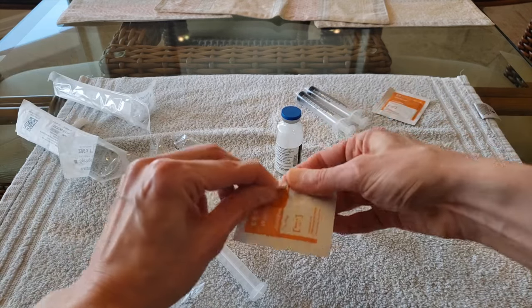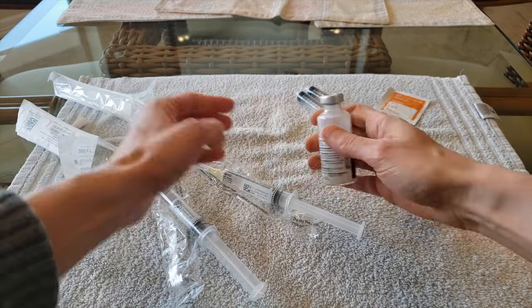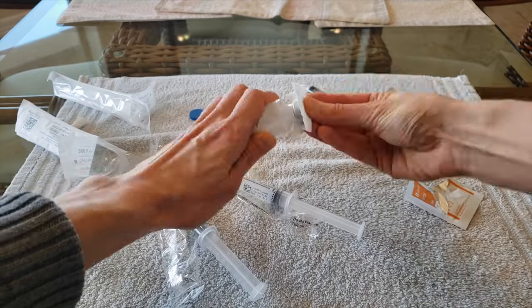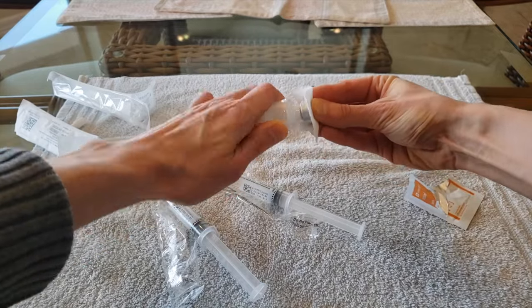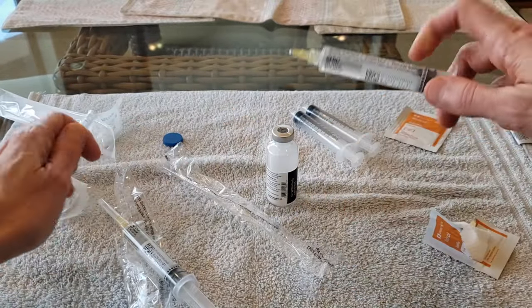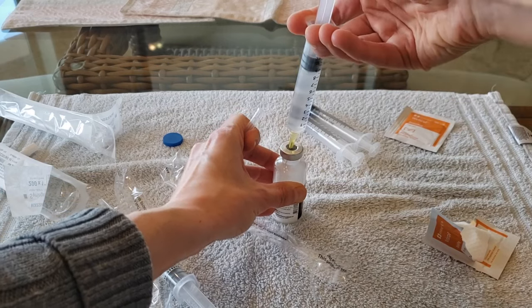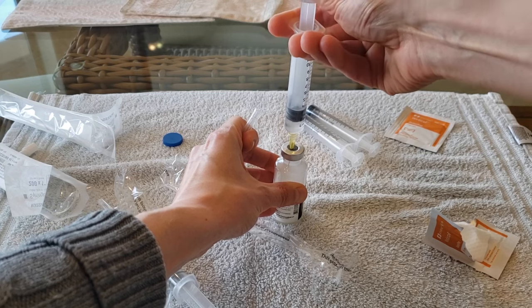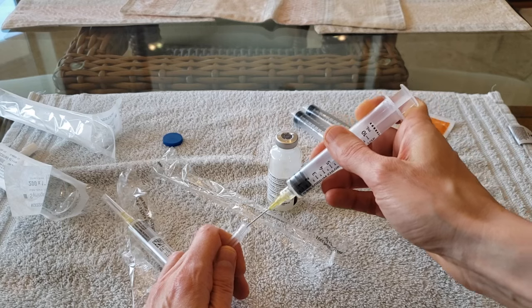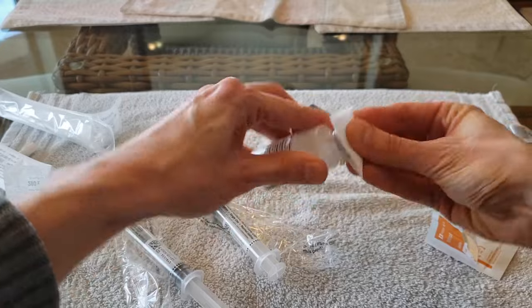Next, I open an alcohol wipe and pop off the top of the meropenem vial. I scrub the top of the vial with the alcohol wipe. I then remove the cap on the needle and infuse the entire saline flush into the vial. I remove the needle from the vial, place the cap back on the needle, and set down the empty saline flush. I then wipe off the top of the vial with an alcohol wipe.